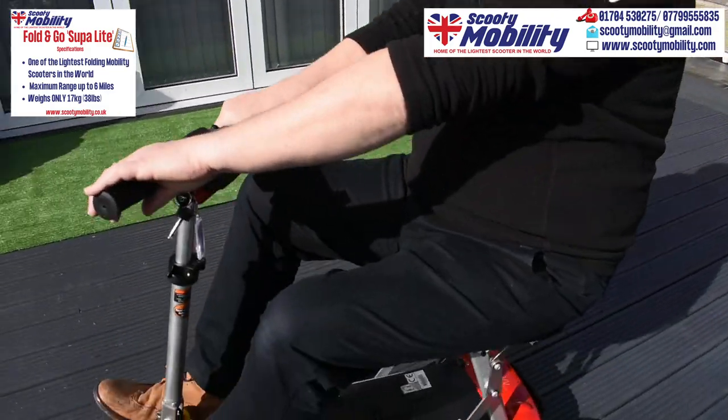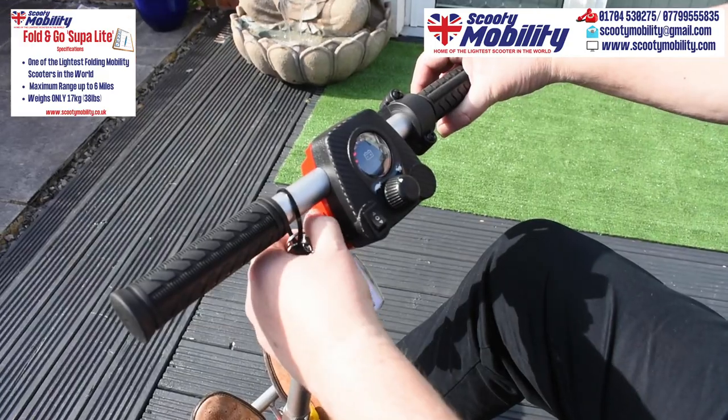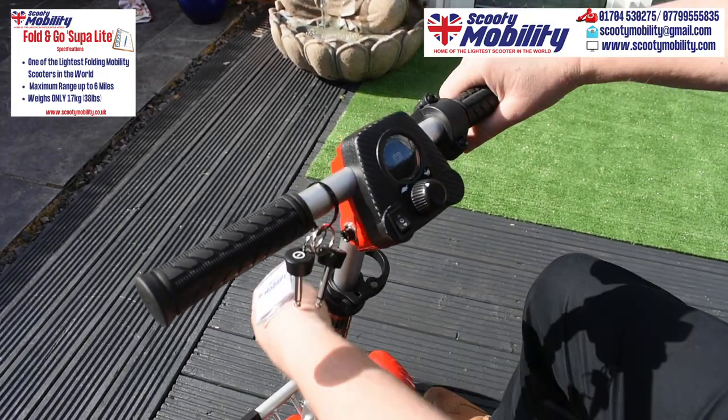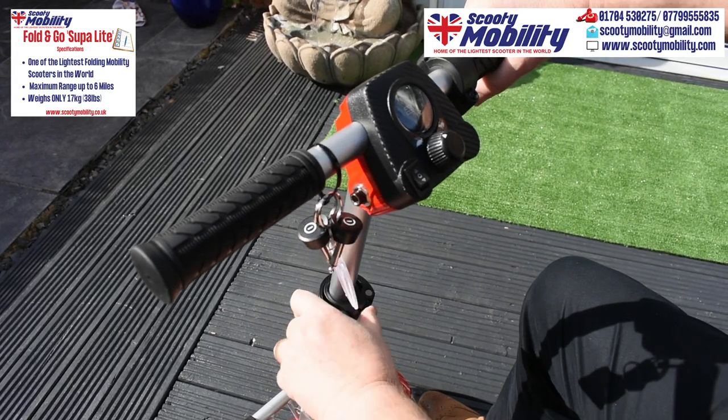It has a dashboard with a digital display and keys. There's speed control on the dashboard, so you can adjust the speed to different speed settings, and adjustable height and steering. So there you go with the Superlite.